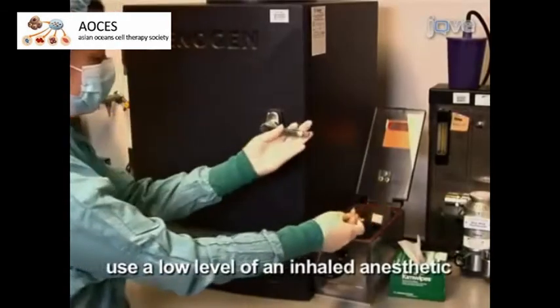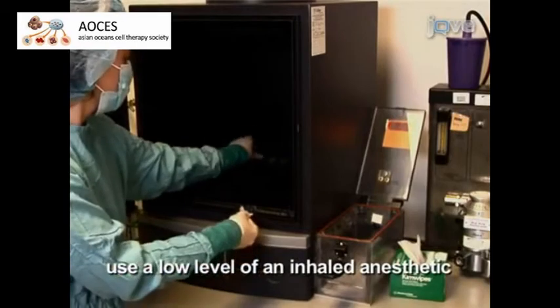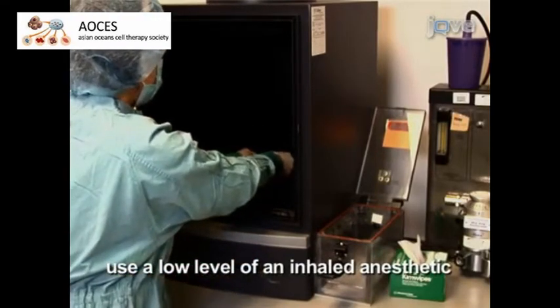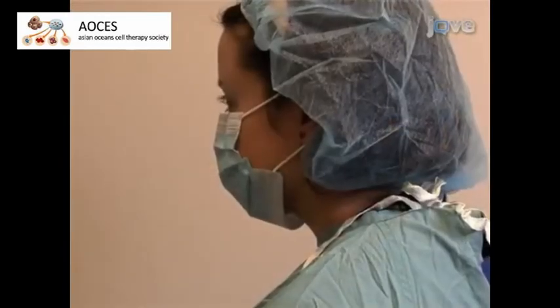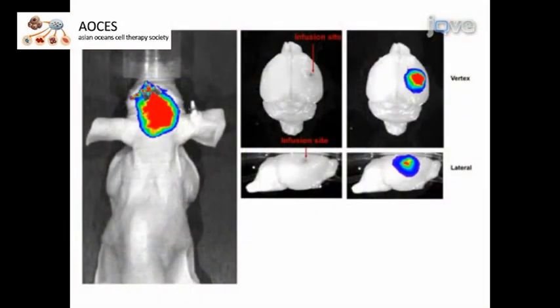To perform imaging of fluorescent-labeled infusate following CED administration, position the anesthetized mouse dorsal side up in an imaging station. Using an appropriate filter setting for the fluorescence that is being imaged, acquire an image. For CED, a successful infusion should show most of the material in the skull near the infusion site. A lack of adverse reaction to administration of therapy is an important indicator of successful injection.